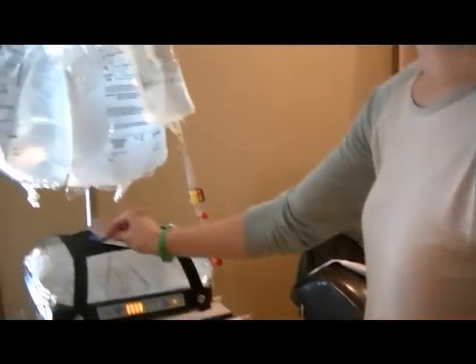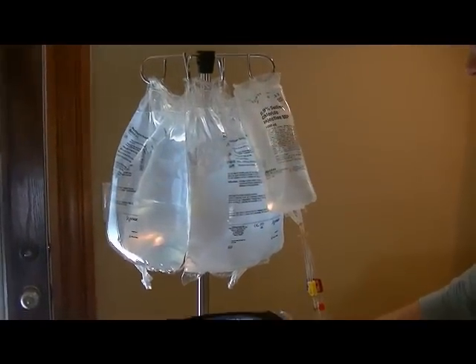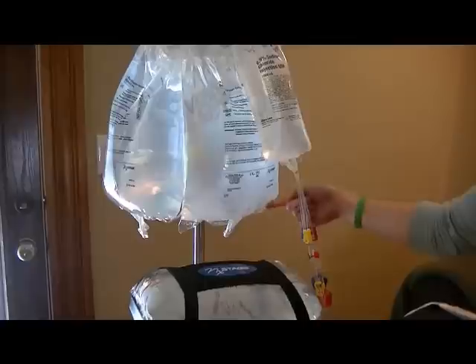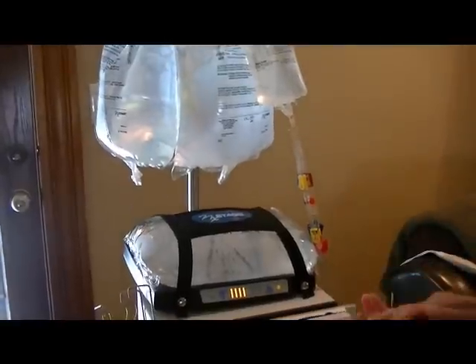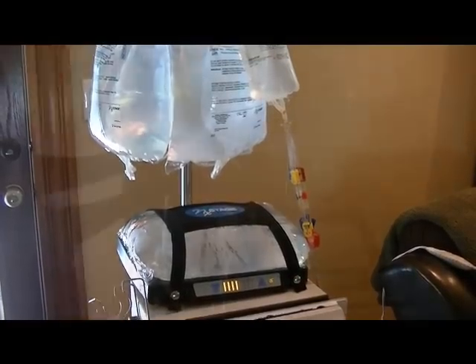The bags of dialysate are the big bags that we have laying here. This one lays on the heater. These are orange and when it gets warm to the right temperature, these turn green. It will continually be going into this bag so that it's warming all the time before it goes into him. He gets pretty cold while he's on it too.